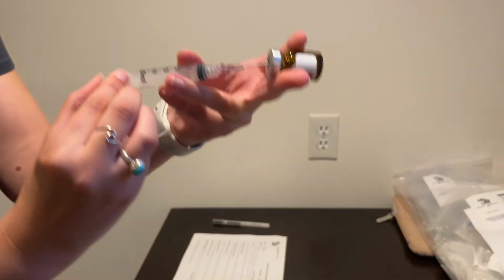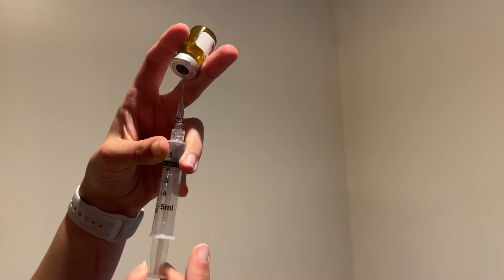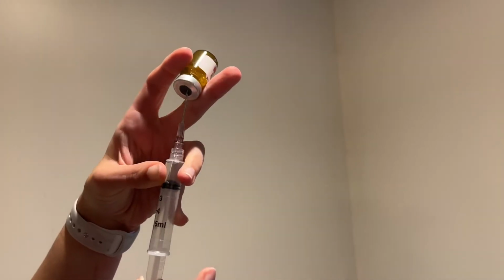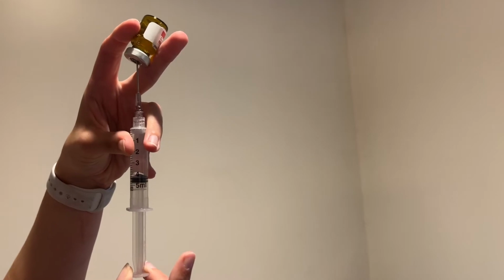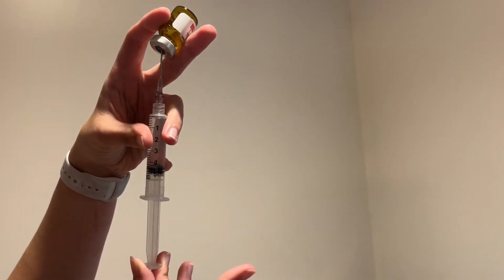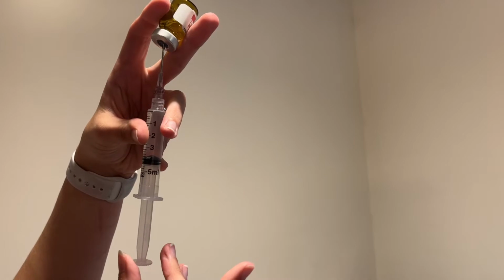I'm going to turn it upside down and start to pull back the med. So I'm going to just draw a little bit past and then draw back up to 4 mils.